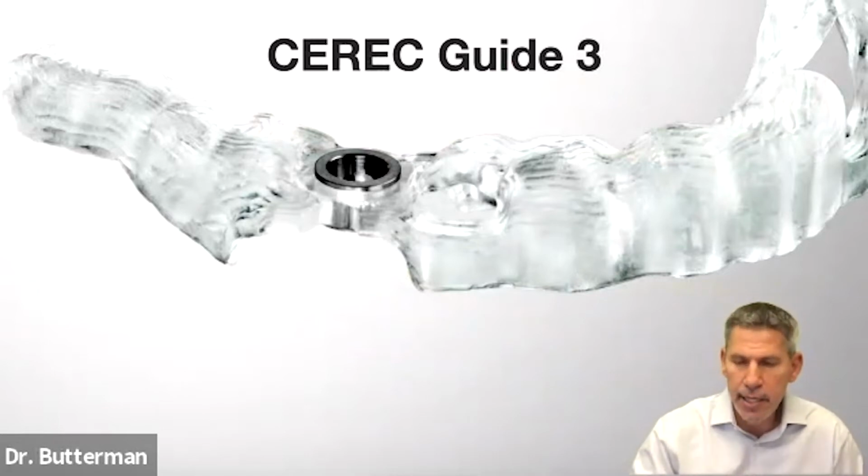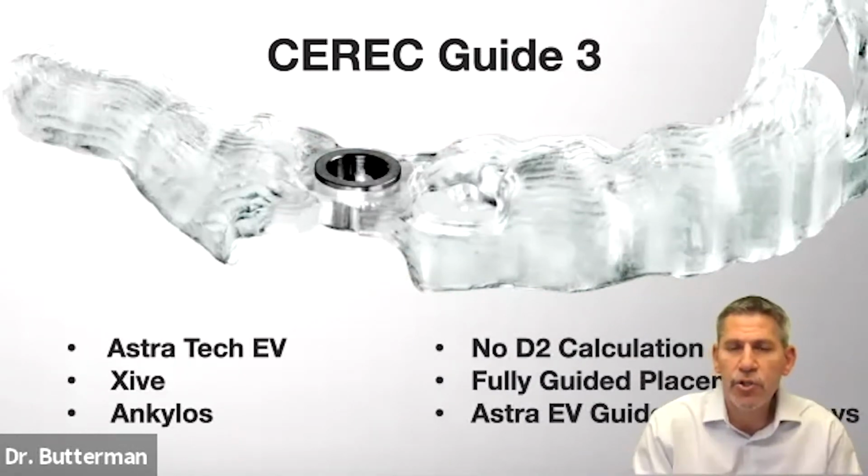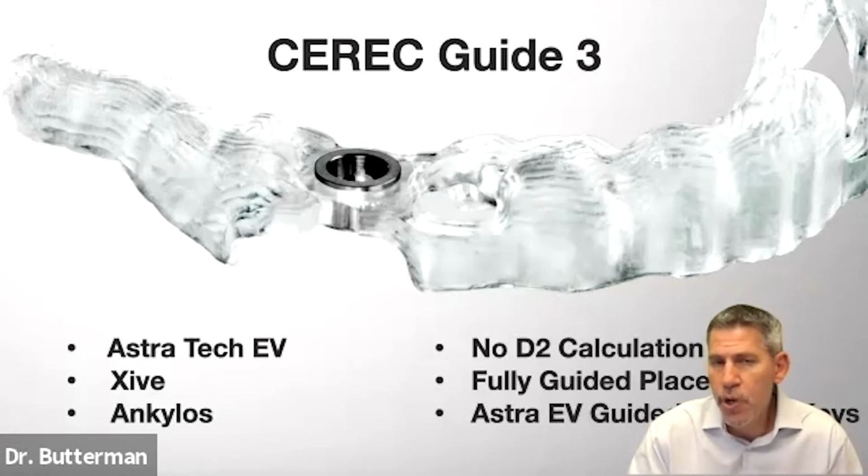Now, CEREC Guide 3 is the latest version of guided surgery from Dentsply Sirona. It is compatible with our Axeos scanner. It's compatible with the imaging that we do with CEREC, and it's compatible with Dentsply Sirona implants, mainly Astra EV, Ankylos, or Xive. Now, if you don't use that type of implant, we can use the CEREC Guide 2.